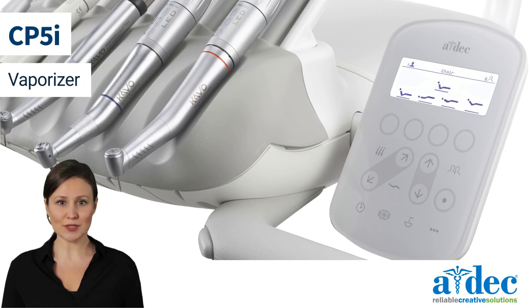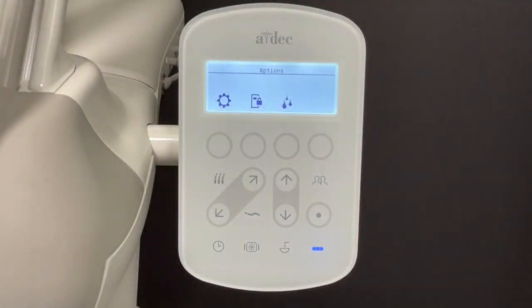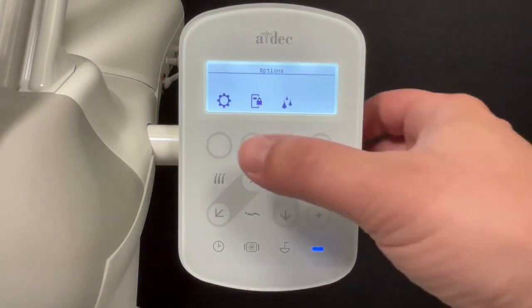In this video, we will discuss enabling and disabling the vaporizer on a CP5i control pad. Begin by pressing the Options menu button. Enter the Settings menu.